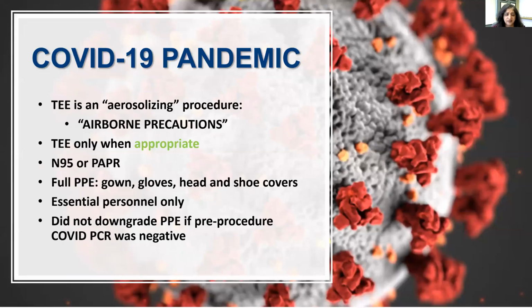A few last words on the COVID-19 pandemic. I know we've all lived through it. TEE is an aerosolizing procedure, as we all found out. For TEE, airborne precautions were what was recommended by the CDC. We did TEE when it was appropriate, and we tried to avoid it when it was inappropriate. We performed TEE with full PPE, including N95. Other institutions have used PAPR, and we tried to limit it as much as we could to essential personnel only.